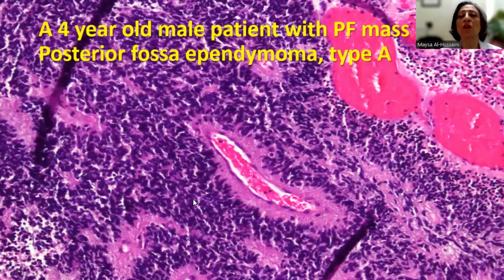So essentially, the final diagnosis of this case would be posterior fossa ependymoma type A.